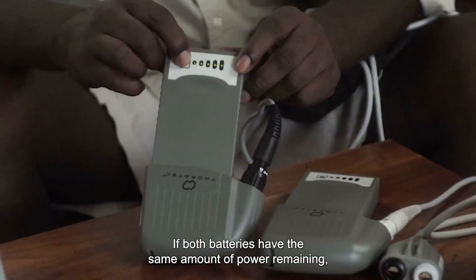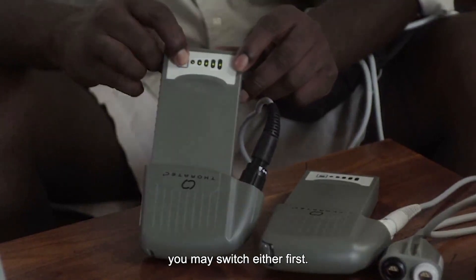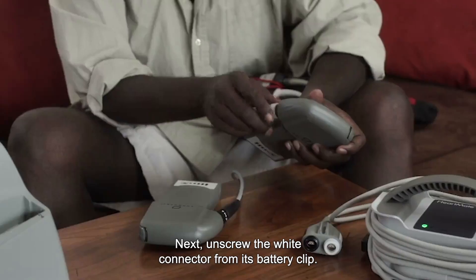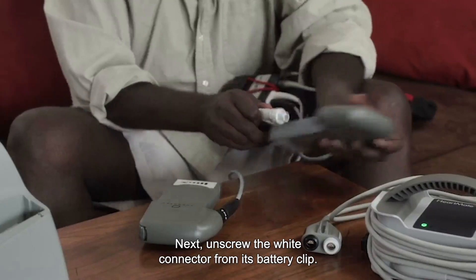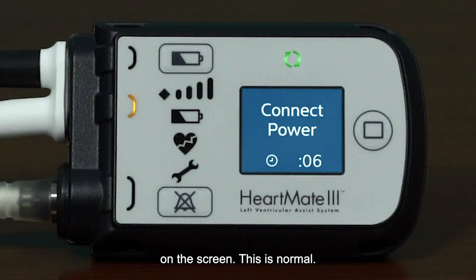If both batteries have the same amount of power remaining, you may switch either first. Next, unscrew the white connector from its battery clip. The power cable disconnect alarm sounds and the connect power message displays on the screen. This is normal.